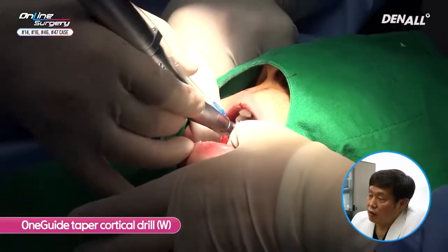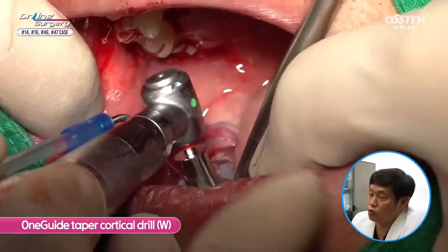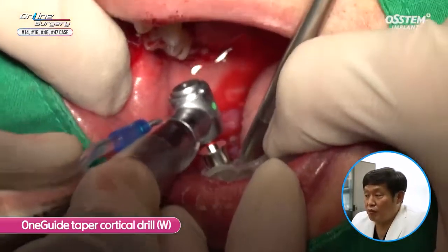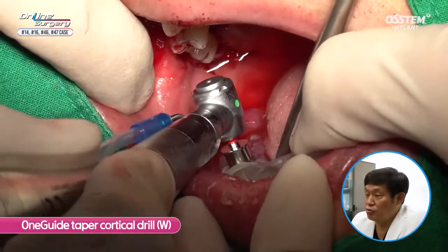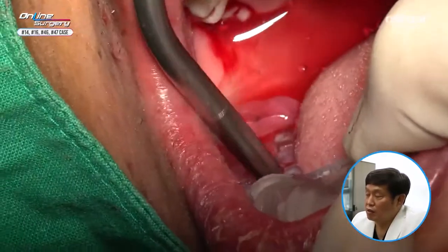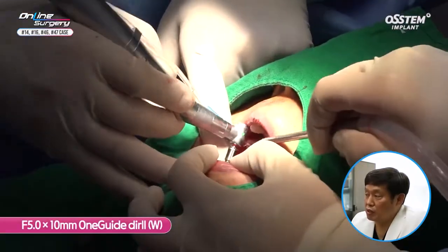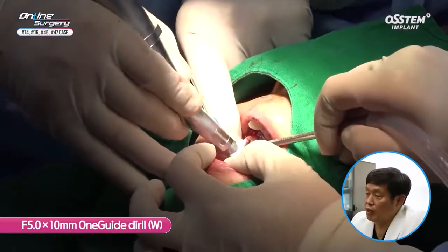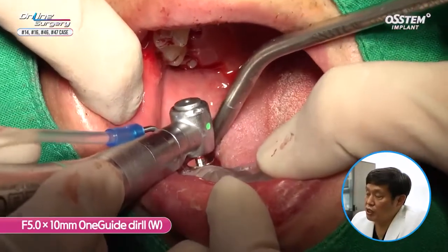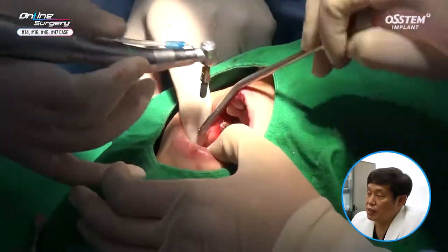If the bone is hard as is now, 1 to 2 taper drill, you can use 5.5 drilling, but OneGuide drill does not have 5.5 drill, but there is cortical drill. This can be used for such purposes. In the superior part, I am using the cortical drill to remove cortical bone. 5.0 by 10 millimeter OneGuide drill is used full length sufficiently. And now I'm attempting to place the implant once again.